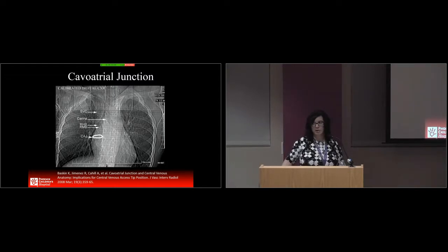The vertebral body unit includes the vertebral body and intervertebral disc space. So when you look at this rendering, you see that the carina is at the superior end plate of this vertebral body. So going down 2 vertebral body units, it places the caval-atrial junction at this level. In the past, people thought that the caval-atrial junction was where the right mainstem bronchus crosses the right heart margin. So we know that's not true. It's much lower than was believed.